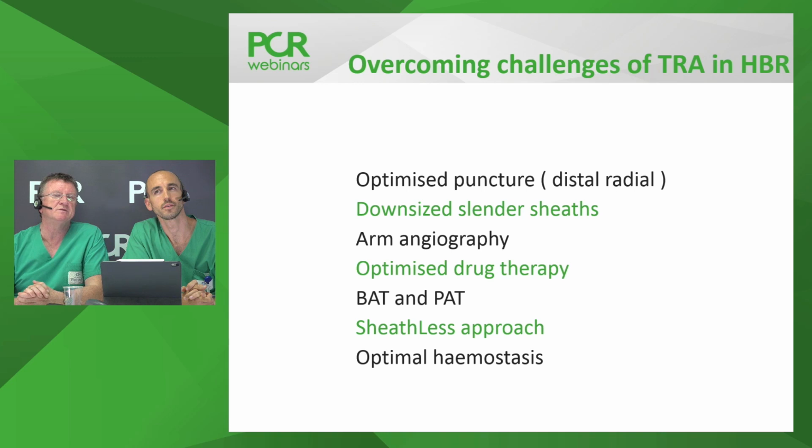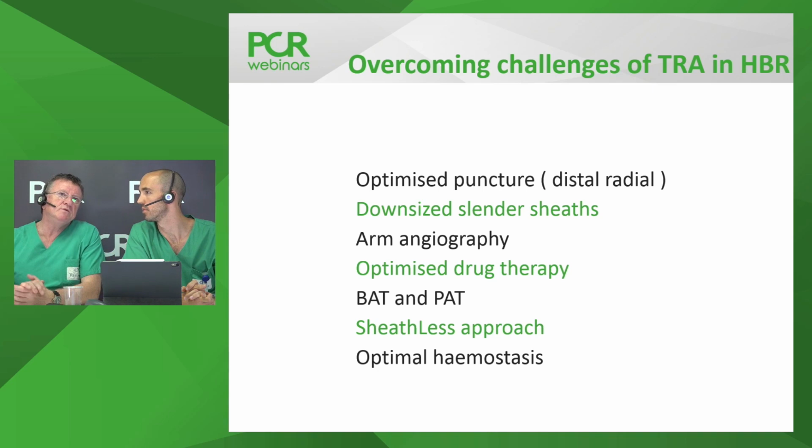Yeah. Balloon assisted tracking and pigtail assisted tracking. Do you use balloon tracking very much? Yeah, we use it quite a lot. So if you have tortuosity or a small diameter loop, you can deploy an angioplasty wire up the vessel. You then insert a balloon through your guide catheter. You deploy it halfway out at the end of the guide and inflate it, and that smooths the transition from the wire into the guide. And you can easily track around loops or through tortuous segments.